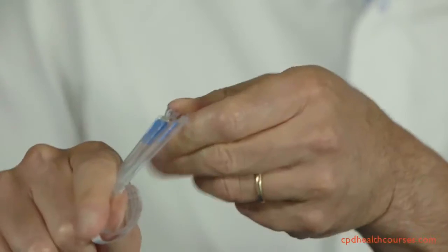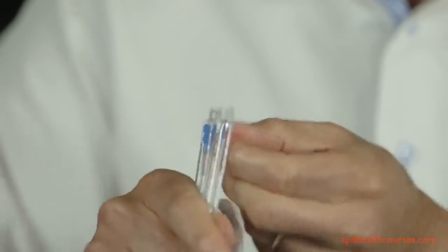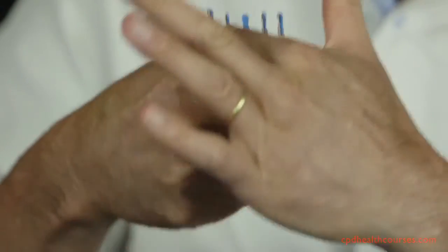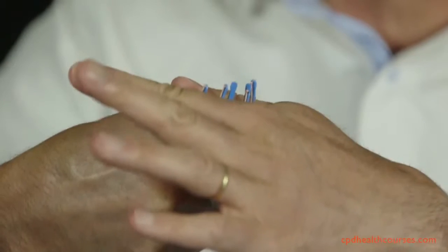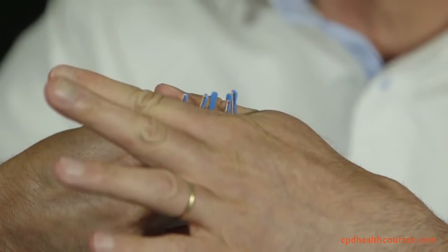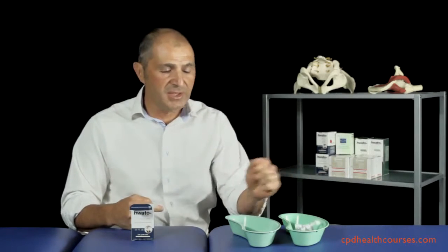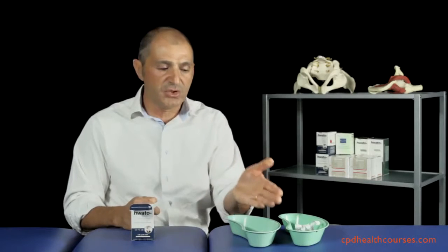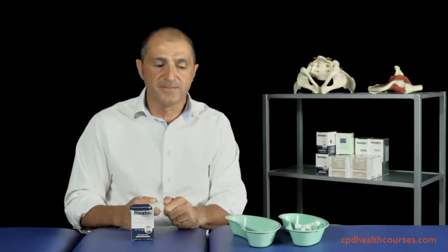Okay, remove the wrapping like so and bend back the plastic. Grab with a pincer grip between my thumb and index finger all the guide tubes, pull them out and pop them into the kidney dish. Then put the wrapping in a separate kidney dish so that you've only got the acupuncture needles in one kidney dish and all the wrapping in another.